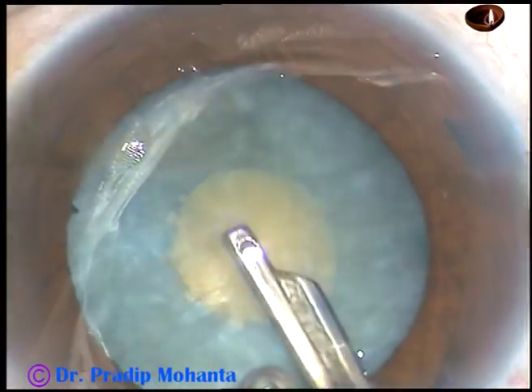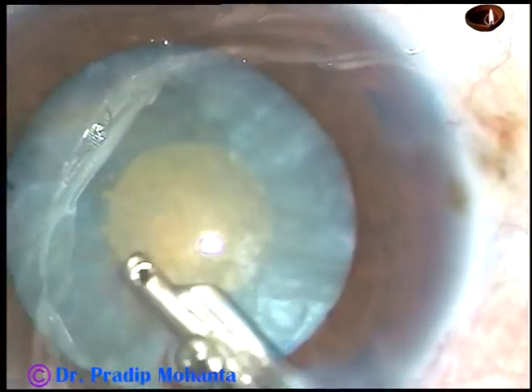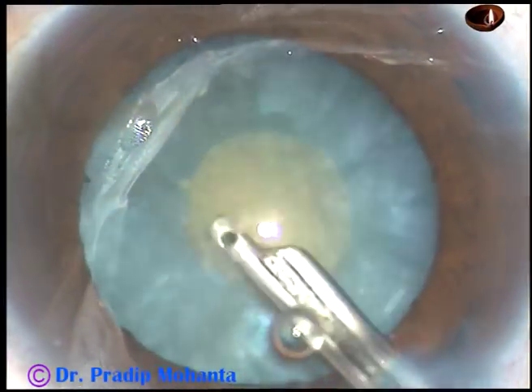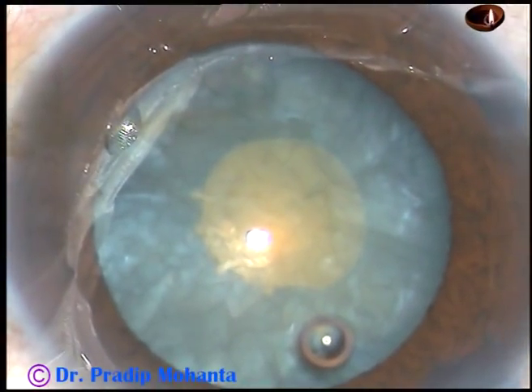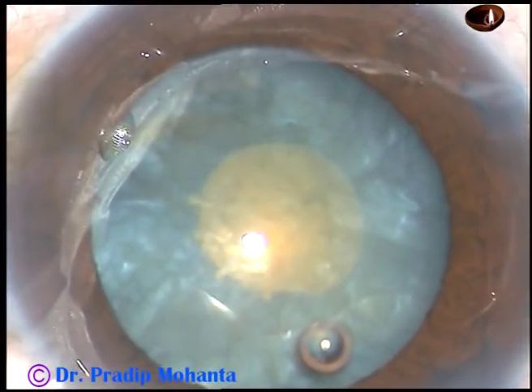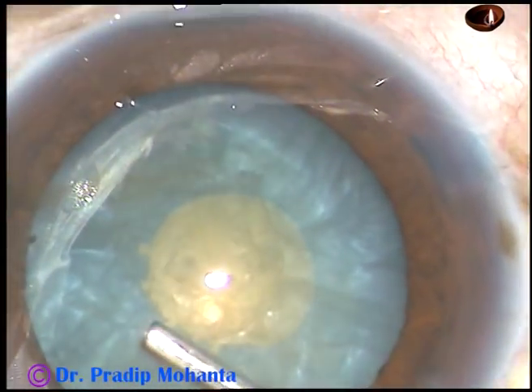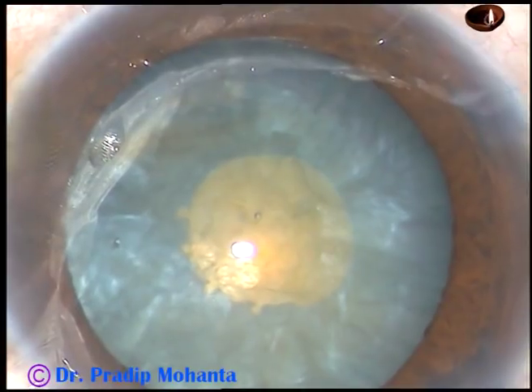As soon as I remove some cortex and inject viscoelastic substance, the anterior capsule will be flat and the chance of rhexis runout will be almost zero. This is the viscoelastic substance, and the anterior capsule is flat now.